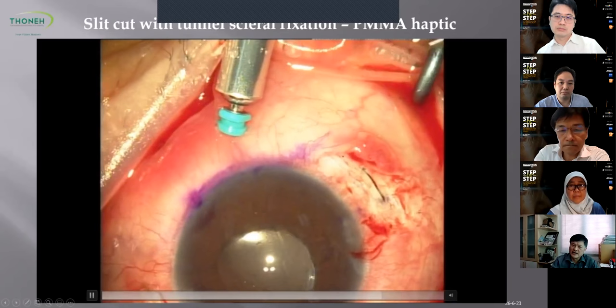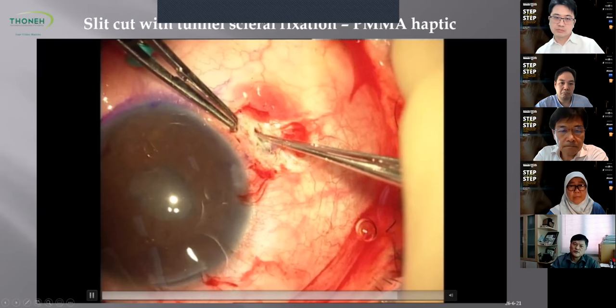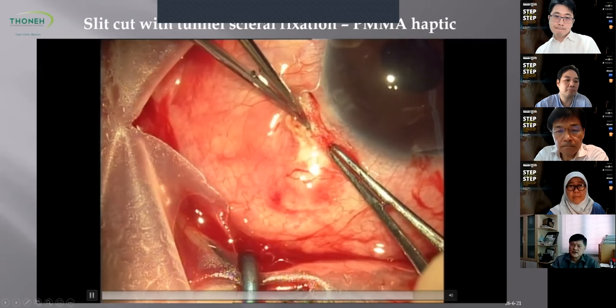Then you have to repeat this procedure on the other side. As long as you pull up in a gradual fashion, this haptic will remain stable. The next step is to tuck the haptic into the tunnel that you have created earlier, on both sides. How much to tuck in depends on the centration of the optics. This method is very easy in terms of centering the optics, okay?